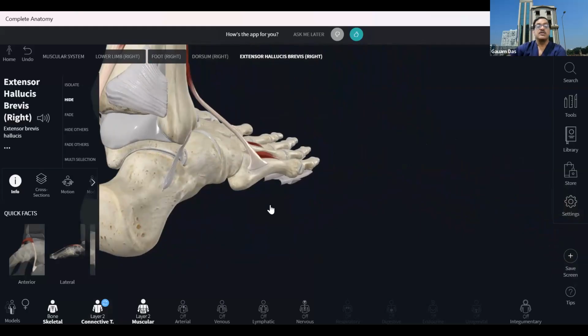These are the injections. So subtalar injection is one of the important areas in ankle arthritis. Either the tibiotalar or the subtalar joint might be involved, and based on that, we can go for intraarticular injections.